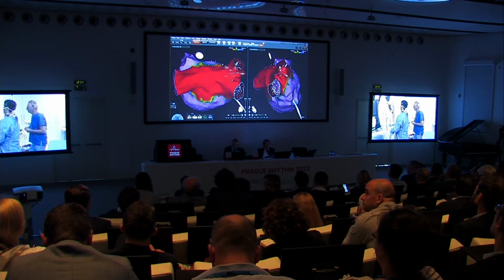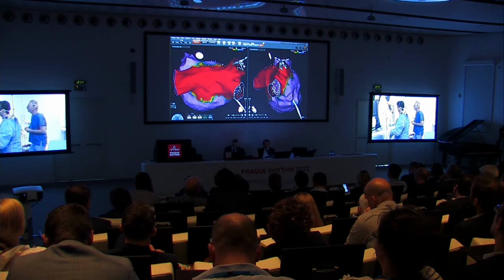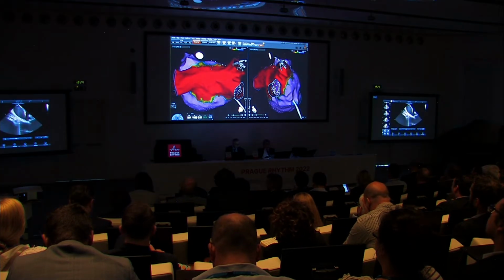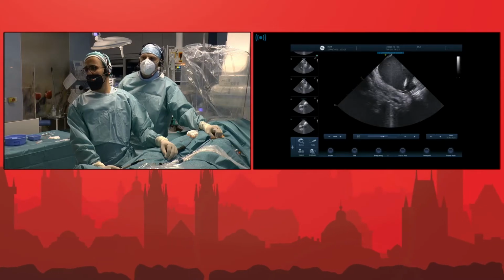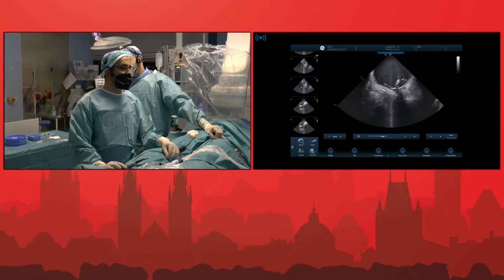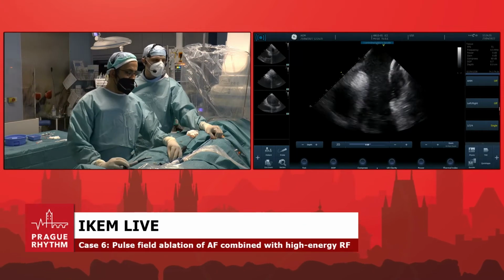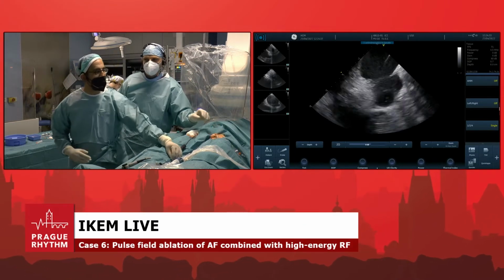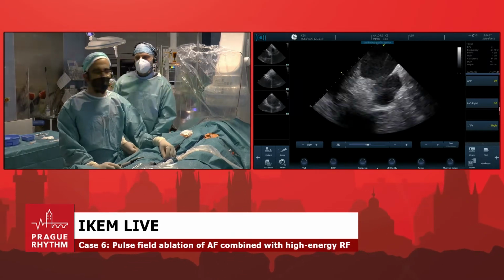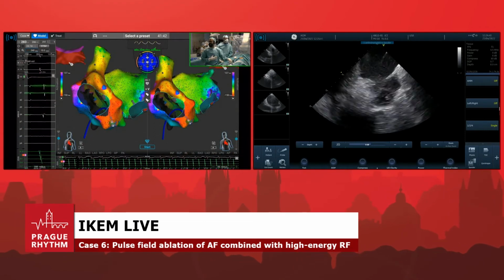So can we maybe now switch to the IKEM first lab, where Peter Peichl is? Okay, we are here. So we have a running atrial tachycardia, and Elad will explain what was happening. So guys, let's just go back to where we left off, and we'll explain what happened. Can you show the left atrial map?